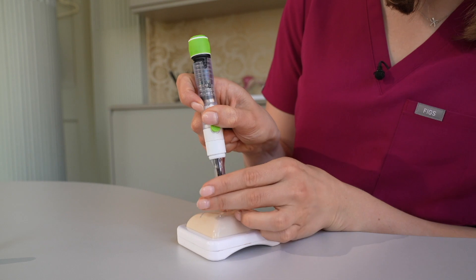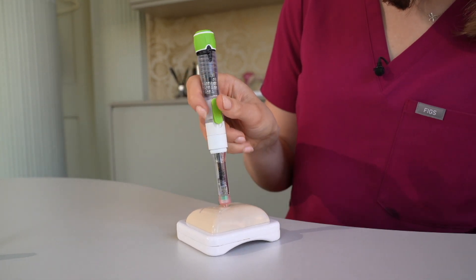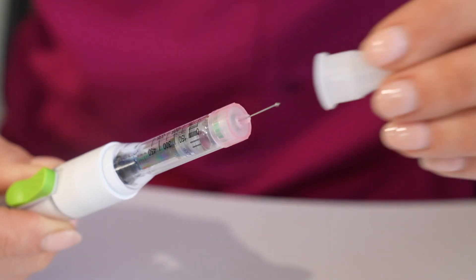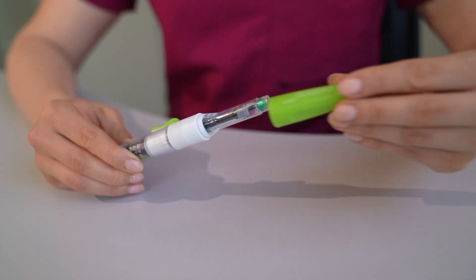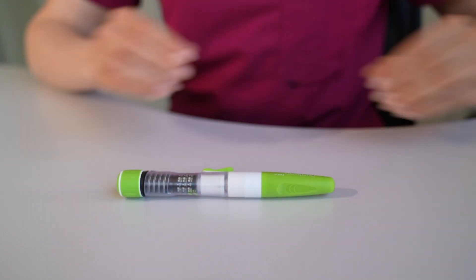Hold for a few seconds to allow for absorption and you can then remove the needle. A small drop of fluid or blood is nothing to worry about. Recover the needle with the larger cap and then unscrew it to dispose of it safely, preferably in a sharps bin. Put the green lid back on the pen. As it contains medication, it must now be stored in the fridge. And that's it.